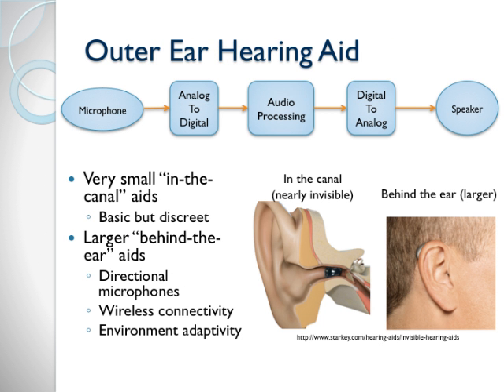Nearly all external hearing aids of today are digital and consist of a microphone or two, analog to digital converters, digital audio processing, digital to analog converters, and finally audio output to a speaker in the ear canal. Technology has advanced so much that tiny hearing aids can be put directly into the ear canal, going almost unnoticeable to others.